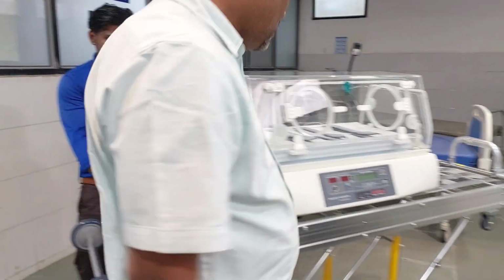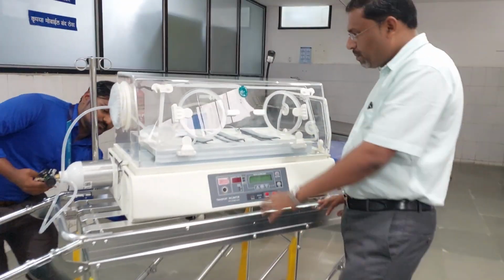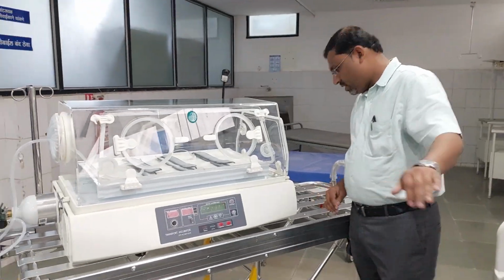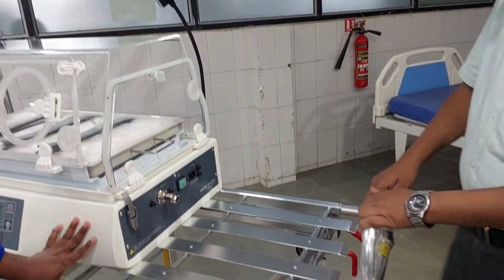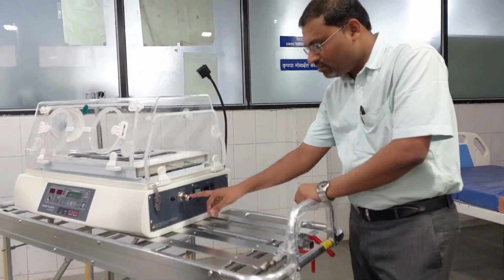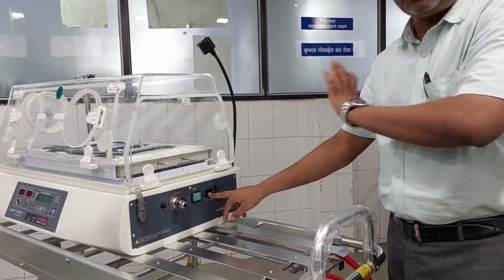Come to this side. After that, see, here they have provided this control panel, for the warm-up purpose. This is the external DC source. Suppose you are going to transport the baby in the ambulance, at that time you can give power from this side. This is the main on-off switch, and this is the AC power source.